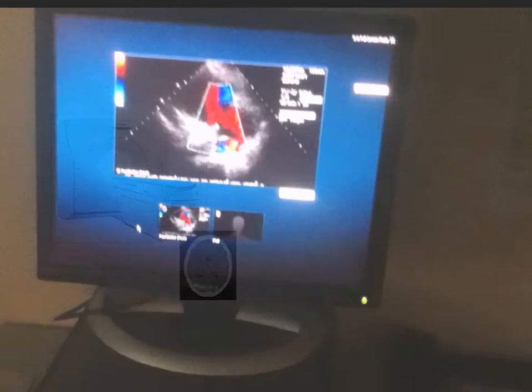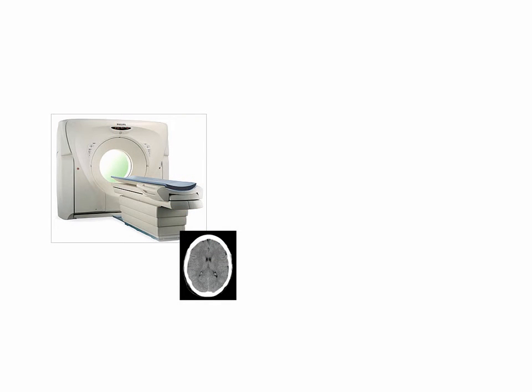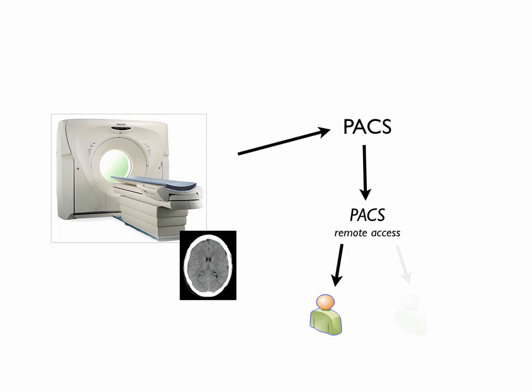If we revisit some of the other modalities, such as CT, there are some advantages to this type of image review as well. So in this case, CT scans are traditionally uploaded to the central PACS server, then to the PACS remote access, and then out to the physician. Each one of these steps takes at least several minutes, and the physician has to log on to something separate to pull these images across to their own desktop. This can cause a delay in time, and actually not everyone is seeing the same specific image that other people on the care team are looking at.